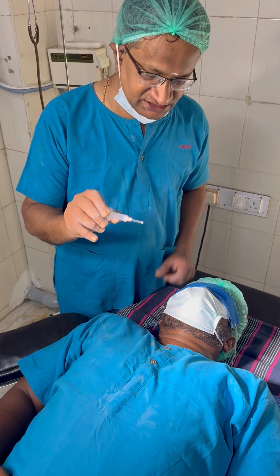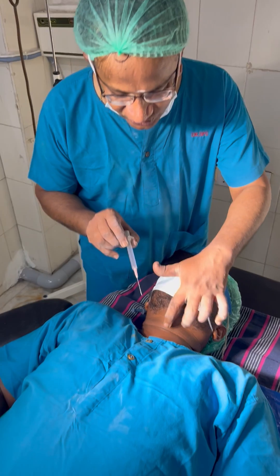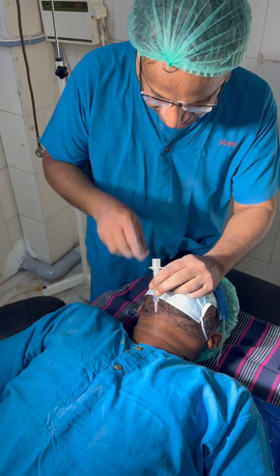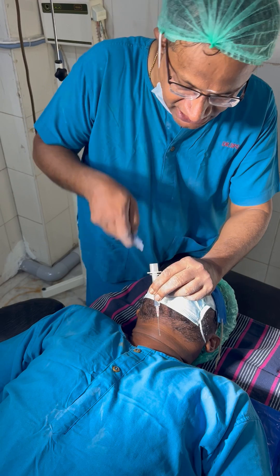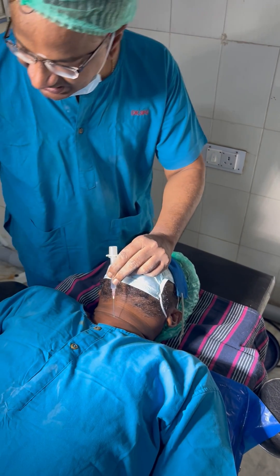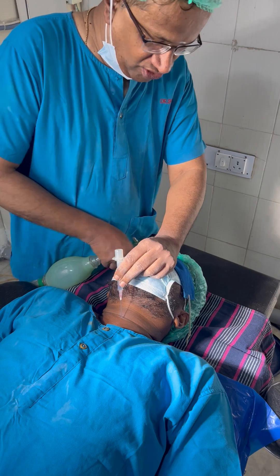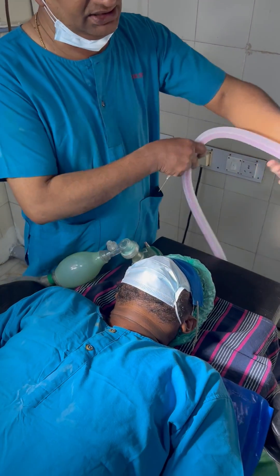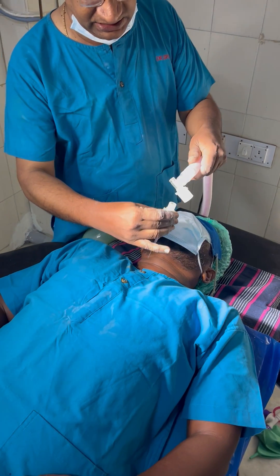The advantage is you have to palpate the cricothyrotomy membrane here and prick it and aspirate it if you want. You can connect it and aspirate for air, and then after pricking it is ready for all your oxygen from here.